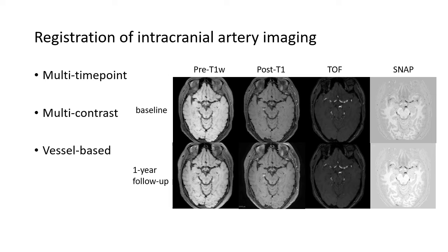Firstly, serial scans are commonly used to monitor tumor growth, post-surgery evaluation, regular follow-up reassessment, something like that. This longitudinal scan registration task is still challenging due to the anatomical structure change over time, differences in scan coverage, and all the other possible factors.